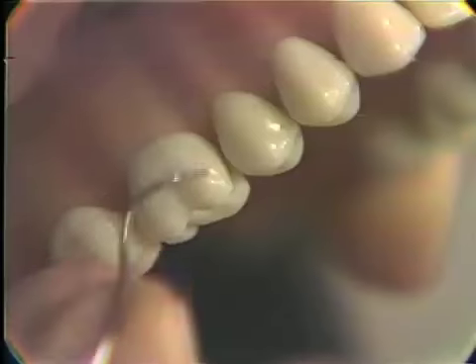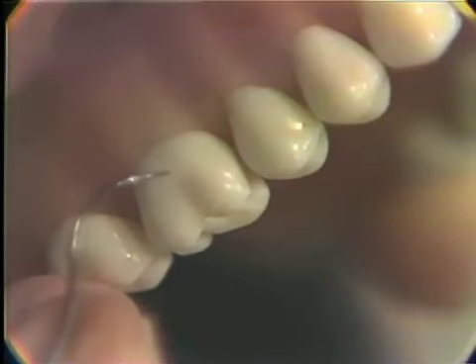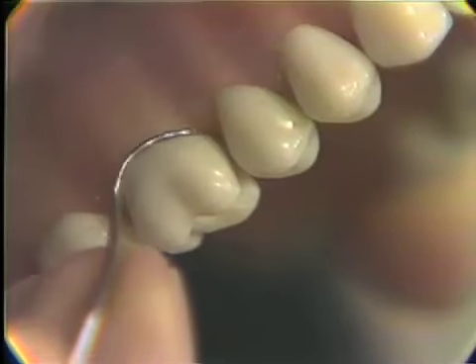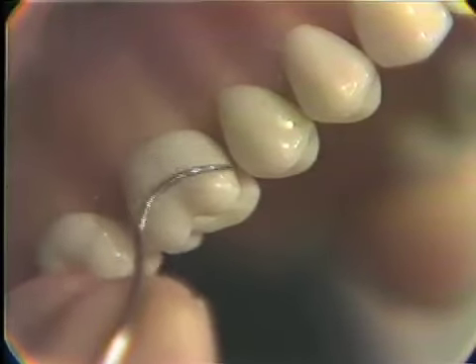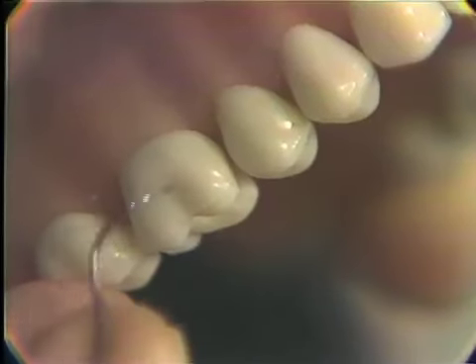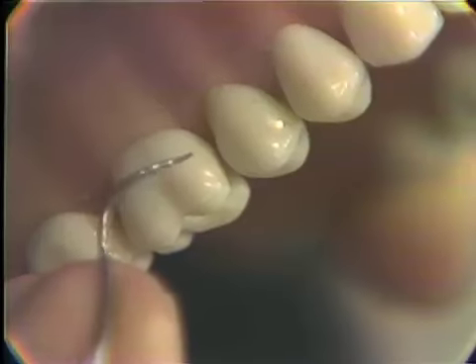Now this is important to us with our elastic impression materials. It saves tooth structure. It also aids greatly in retention. And it is not necessary to reduce this into a wide open taper on this slice. This is again accomplished by the use of the small disc.